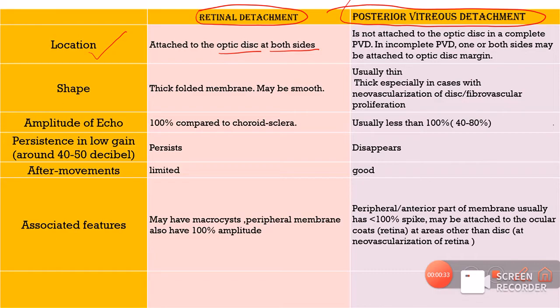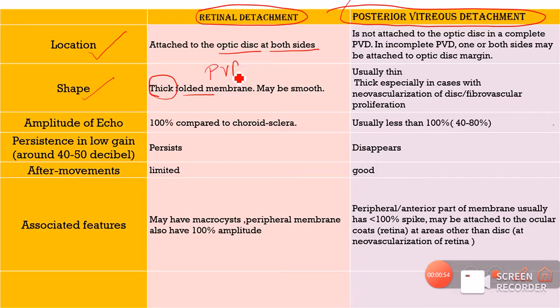Coming to the shape of these detachments, the retinal detachment will usually be quite thick compared to the thin posterior vitreous detachment. So retinal detachment will be thicker and moreover it will have a folded appearance, because of the proliferative vitreous retinopathy changes which occur after a retinal detachment. However, not all RDs are folded — some RDs like shallow RDs can also be smooth.